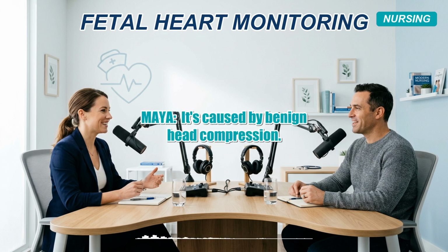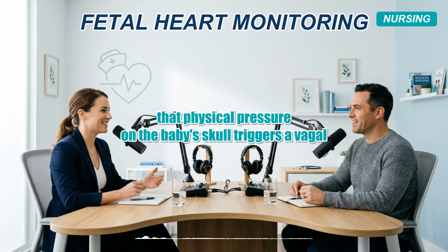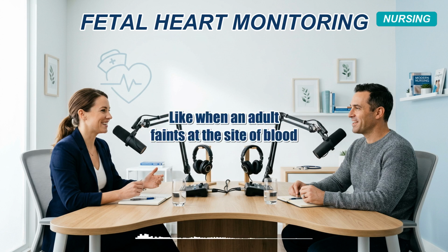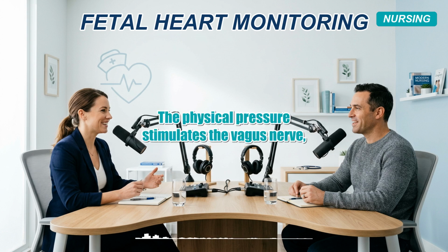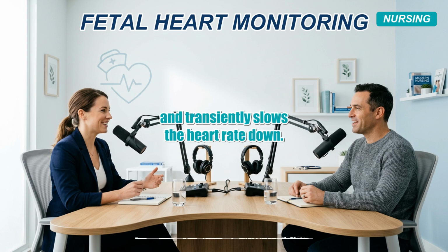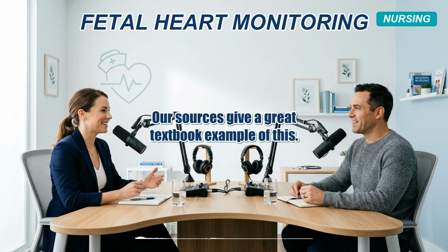It's caused by benign head compression. As the mother's contraction pushes the baby's head against the cervix or the pelvic wall, that physical pressure on the baby's skull triggers a vagal reflex. Wait, like a vasovagal reaction? Yeah. Like when an adult faints at the sight of blood because their heart rate suddenly bottoms out? Exactly the same mechanism. The physical pressure stimulates the vagus nerve, which hits the parasympathetic brake and transiently slows the heart rate down. I really want to emphasize this for you listening. This is totally normal. Our sources give a great textbook example of this.